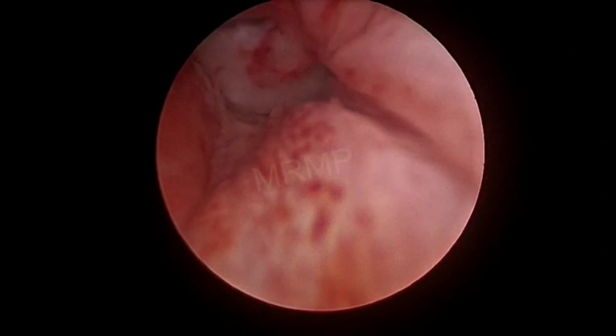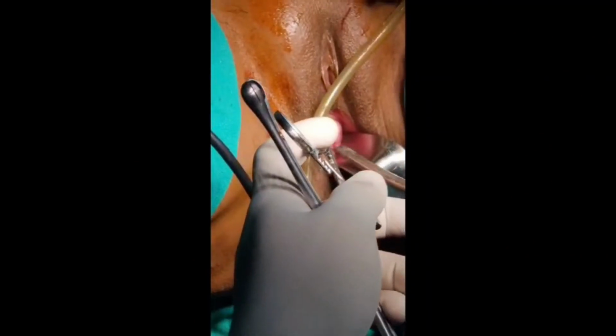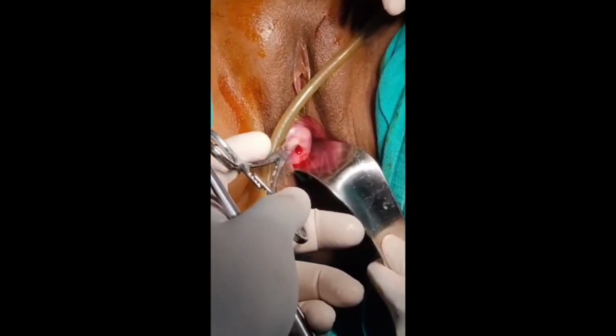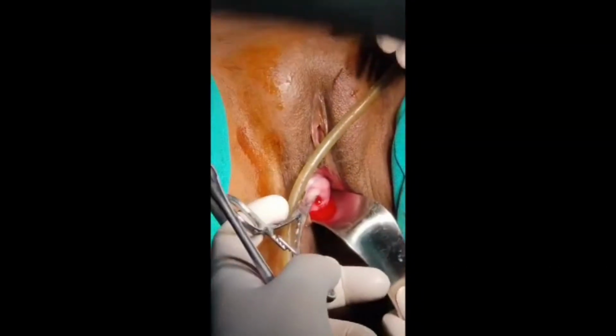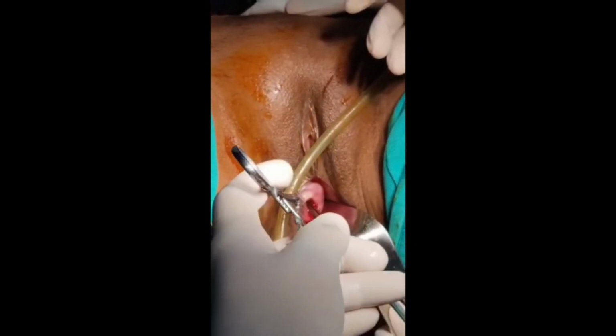The anterior and the posterior wall. This is the polyp peeping through the cervical canal. Then we can take it out with the ovum forceps. The small ovum forceps are very helpful. A bit of dilatation is required to introduce the ovum forceps. So this is very rewarding.